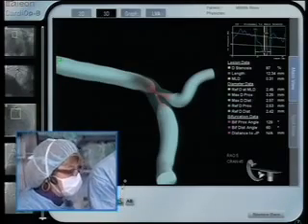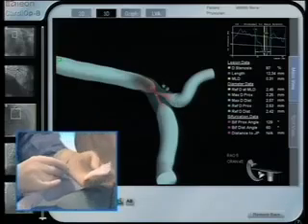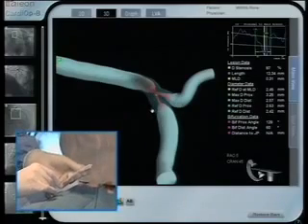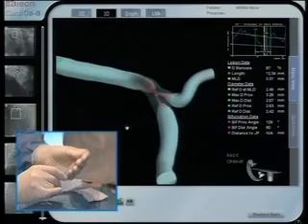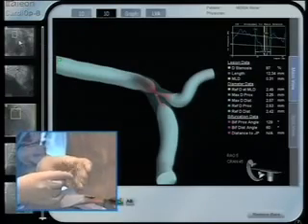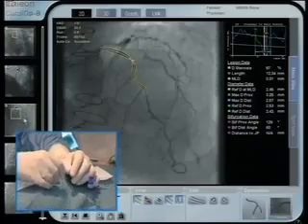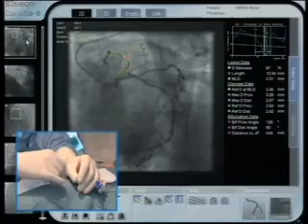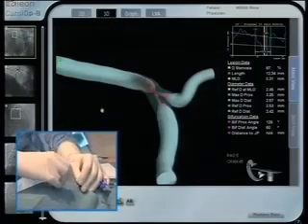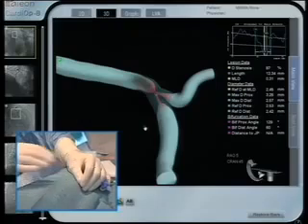That'd be great. Okay, and just a brief comment, Marie-Claude. This is Chuck Simonton. Hello. This is a really great case. Can you explain how the 3D reconstruction is done for the audience? Yes, we have to make 2 views, with more than 30 degrees of difference between them, and then the 3D reconstruction is done automatically, as you see there. We just did it just before.